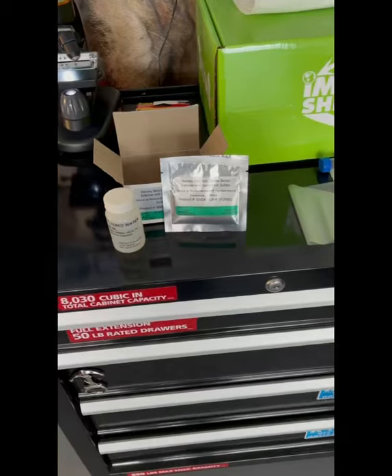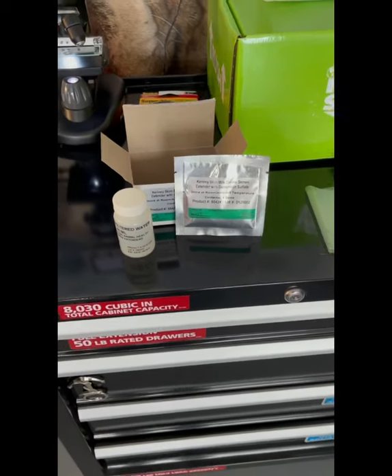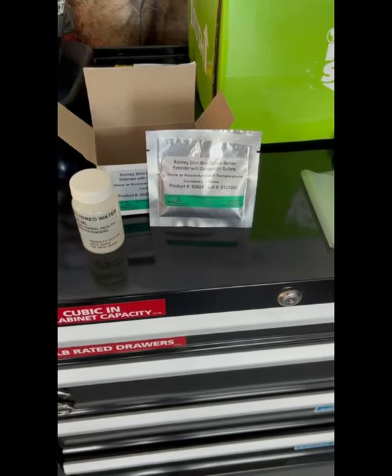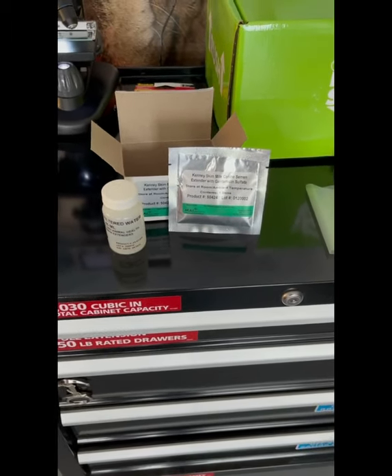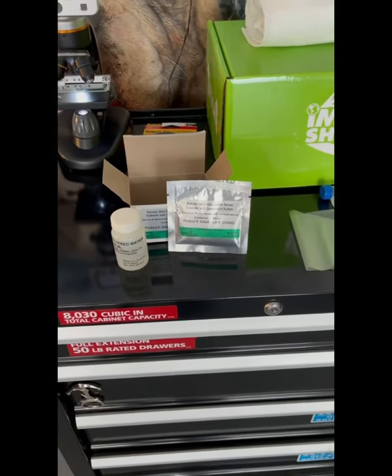Step number one: you're going to open your extender. We have our stir of water and our powder mix. We're going to mix it together, shake well, let it sit for about 20 minutes and it's ready to go.